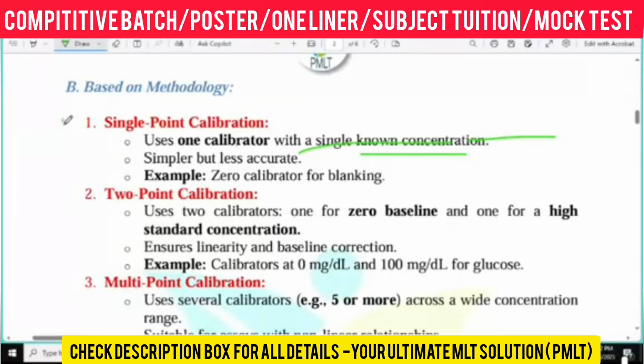Single point calibration means only one calibrator with a known concentration is required. Secondly, it is simpler but less accurate. Too simple means the accuracy level is low, because you are using it a single time, so it's called single point calibration.